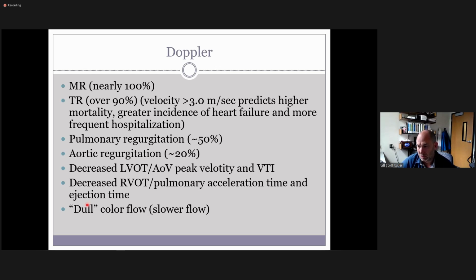I was talking to a tech the other day about this with pelvic ultrasounds and the way that Inland Imaging is doing their protocols. Their standard protocol now for pelvic for females is that they are doing transvaginal first and only if needed, instead of doing transabdominal first. Well, what happens if you thought you got all the information you needed, but you really need to go back and take another look at the transabdominal that you didn't do, and now the patient came from 3 hours away and has gone home already? Okay, so that's my point.